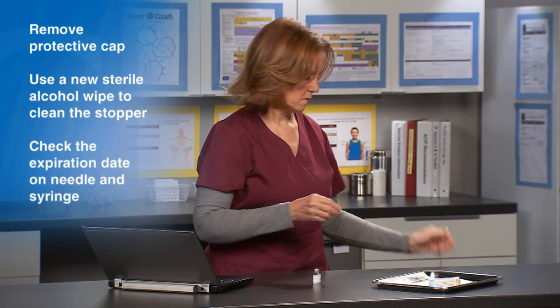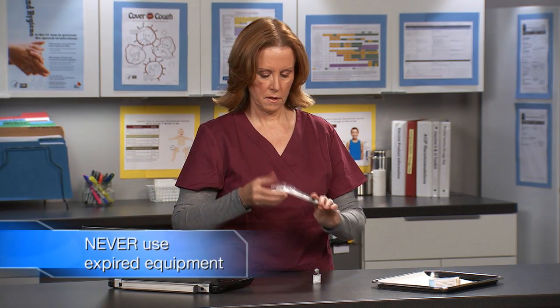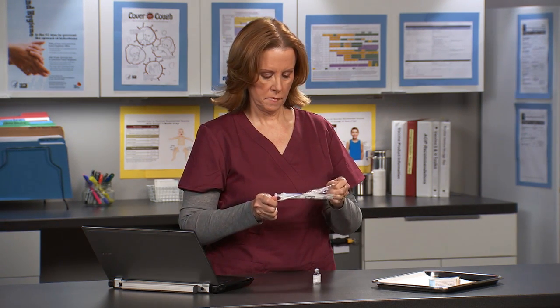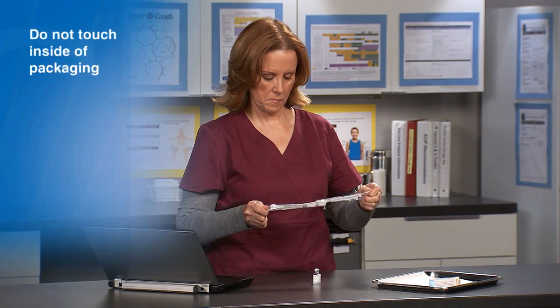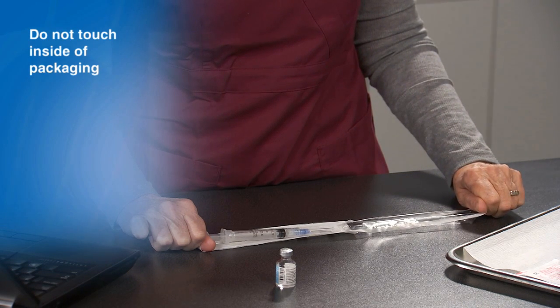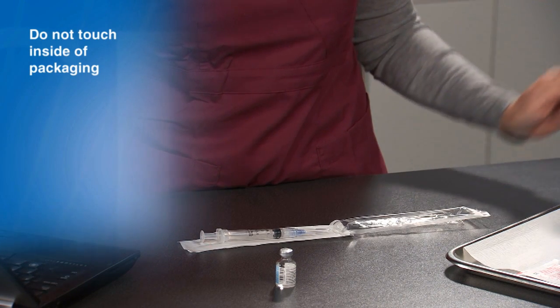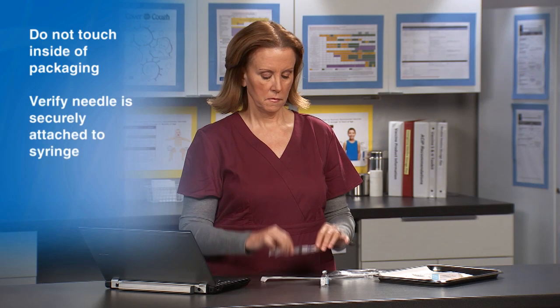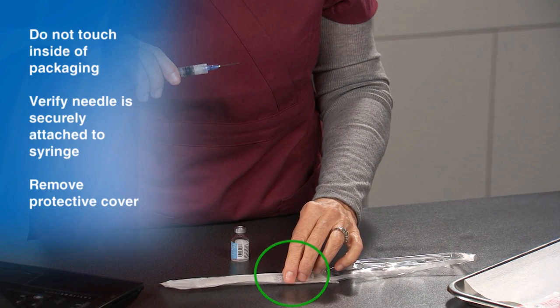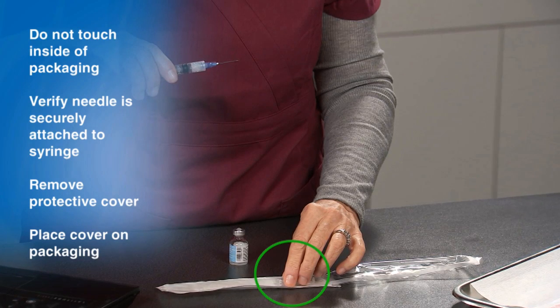While the alcohol is drying, check the expiration date on the needle and syringe if present. Never use expired equipment. Carefully open the needle and syringe, being careful not to touch the inside of the packaging or where the needle attaches to the syringe. Place the packaging inside-up on the counter with the needle and syringe resting on the inside of the packaging. Carefully remove the protective cover from the needle, then place the needle cover back on the packaging.